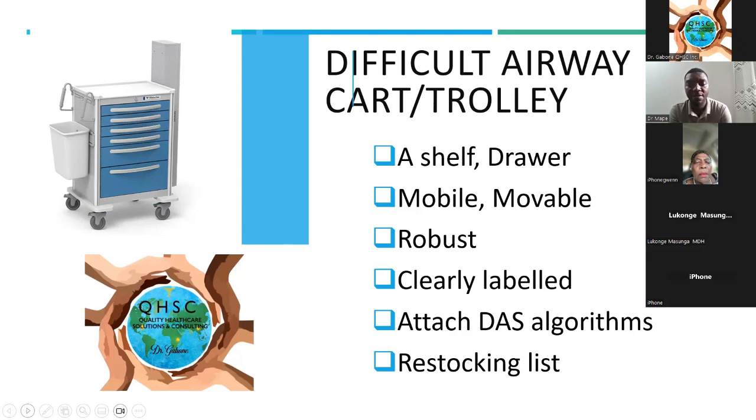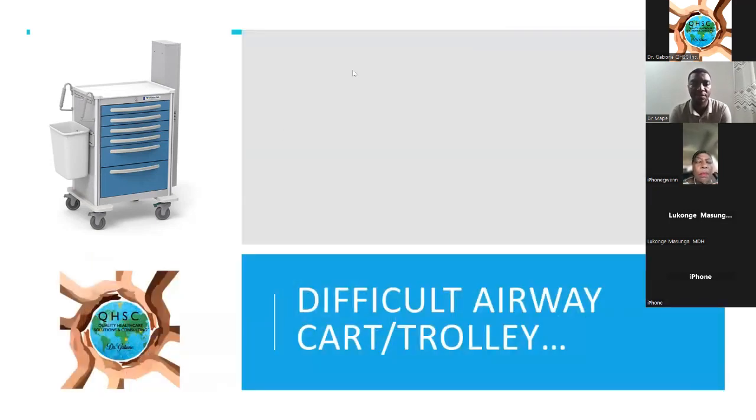And there should also be a restocking list, whereby each day in the morning you check the list, and if you have any supply that has been used, you have to replace it. If it's a drug, you have to replace it. If something is not there and it should be there, you have to replace it. So the restocking list should be done regularly.